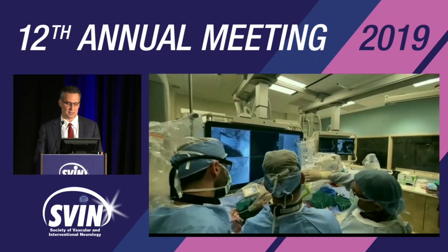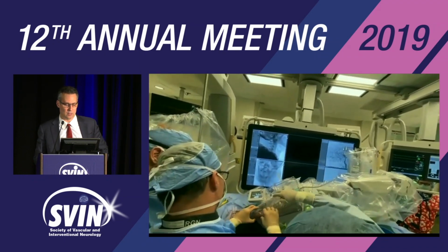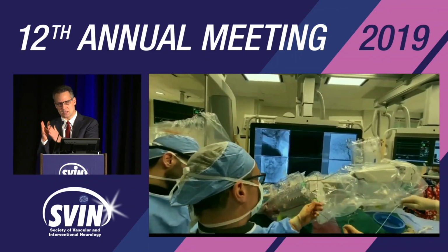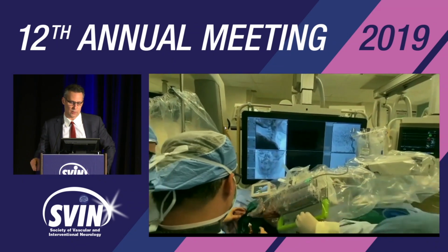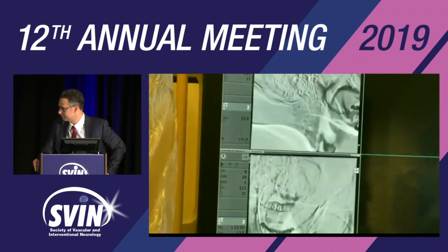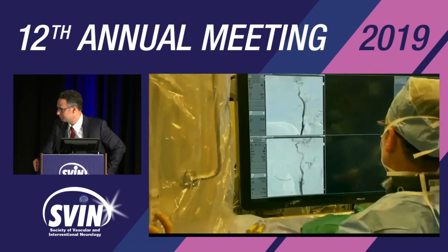And then after that, I can manually remove the rest of the filter, but essentially everything is already out of the patient. And then you can very easily remove the robot, and you just see how easily it moves around and finalize. Think that you just cut radiation? This is the great advantage because you can do it also manually.